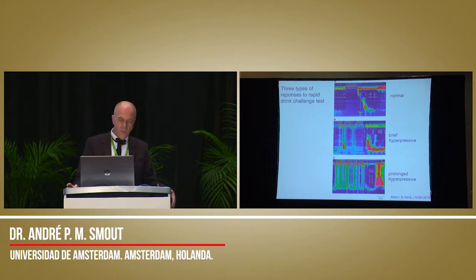It has been shown by this study from Spain that normal subjects do not have a buildup of pressure in the esophagus during the rapid drink challenge test, but people with mild obstruction or severe obstruction, they have a buildup of a pressure in the esophageal body during this drinking.